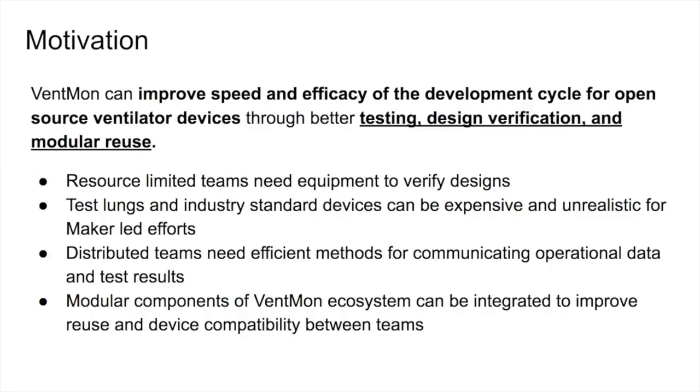So first, let's talk a little bit about the motivation behind VentMon and the problems we were hoping to address with this device. As the pandemic progressed, we saw a lot of teams, primarily composed of makers and engineers, working together to create open source ventilators to help bridge the gap between supply and demand and the current supply chain. VentMon aims to address that need. It is in and of itself meant for testing and verification of a ventilator device. Our secondary goal with VentMon is to promote modular reuse within the broader community and also within the VentMon ecosystem.